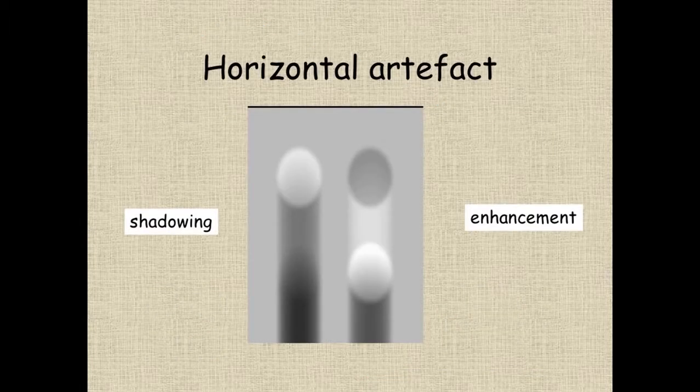There are a number of horizontal artifacts relating to shadowing and enhancement that can be improved by multi-beam technology.